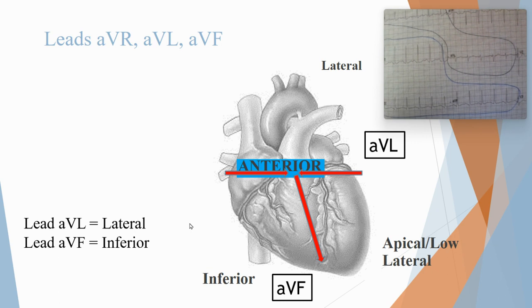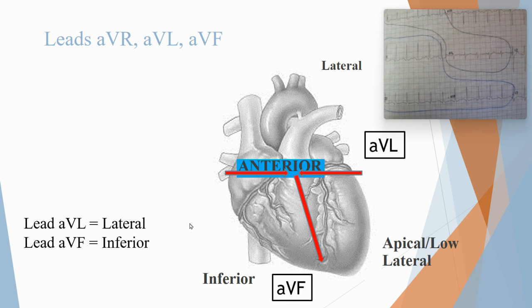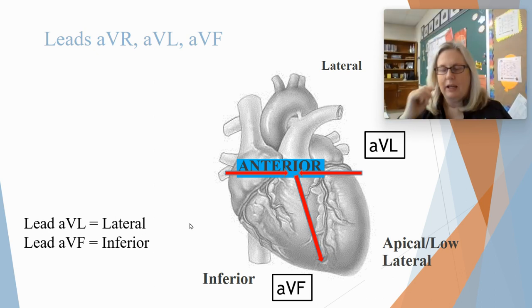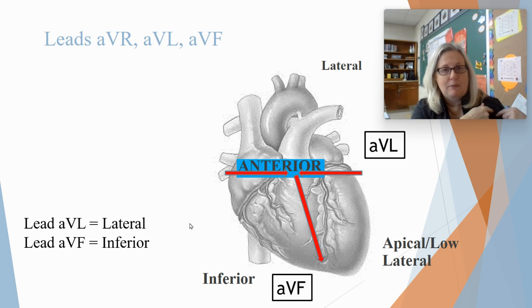Now they go together when we're grouping them together for different regions of the heart. And the reason they're grouped together is because they all end at the same spot when we're talking about lead direction that we learned last class. Okay, so lead direction determines what goes together. And 1 and AVL are lateral because they both end over here at the left arm, lateral or left arm. And then 2, 3, and AVF all land at the left foot, so they're inferior.